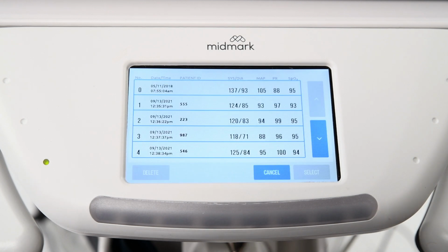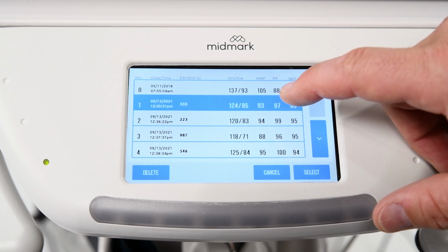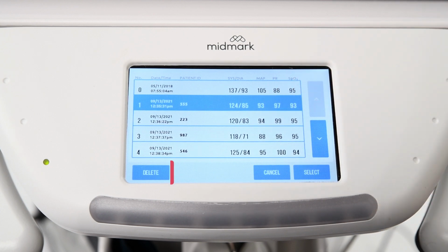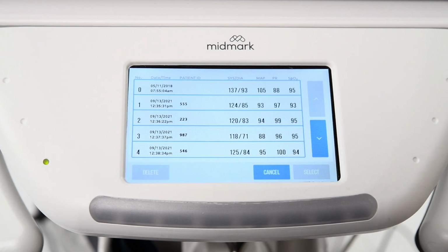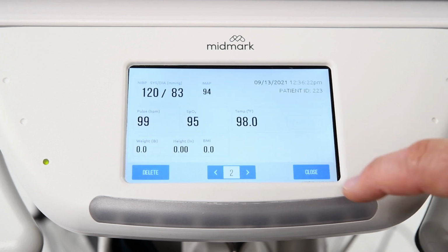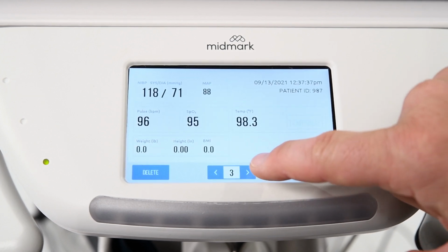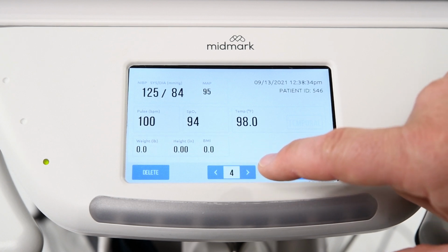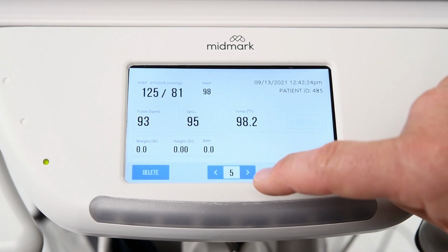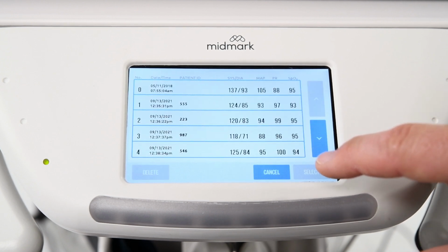Once on the patient record screen, touch the screen to select a record. Once the record is highlighted, the Delete and Select buttons will become active. To view a patient record, highlight a record, press Select, and the detailed patient record will be displayed. Press the arrow buttons in the bottom middle of the screen to navigate through records one at a time. The Close button will return you to the patient records list.